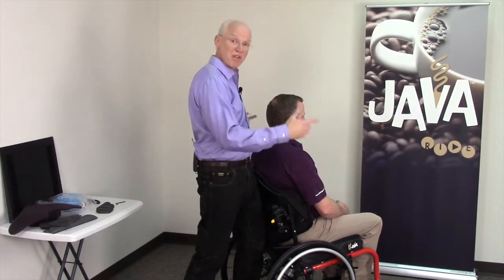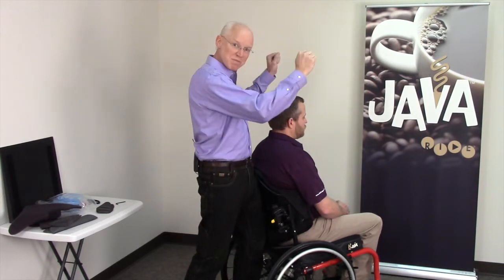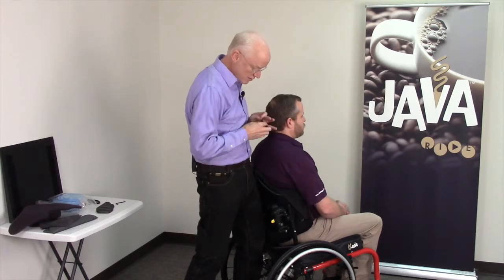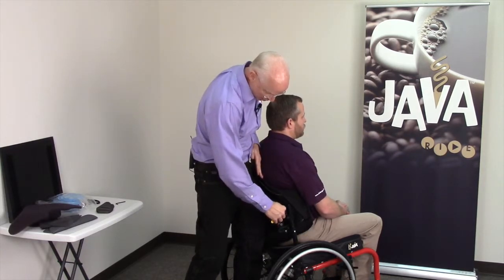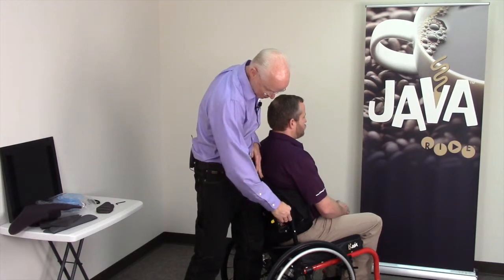It's loose. So the only thing I'm adjusting is back angle. Not depth, not rotation, nothing. Just back angle. So he's feeling pretty good there. I will now tighten down the back angle adjustment.